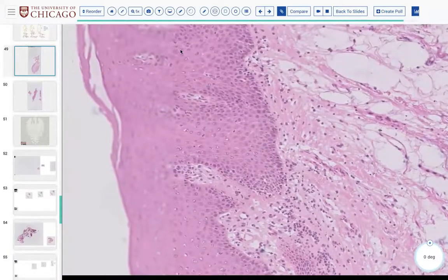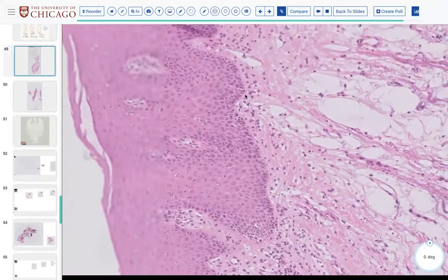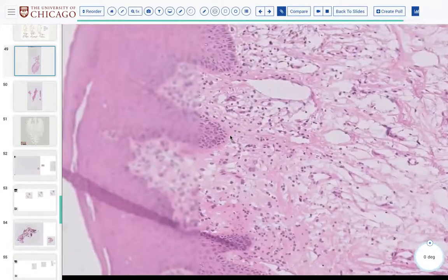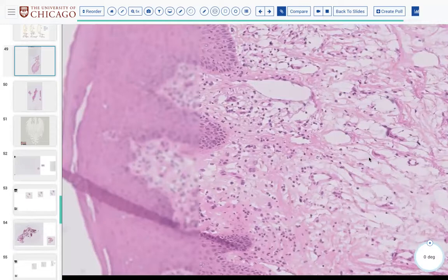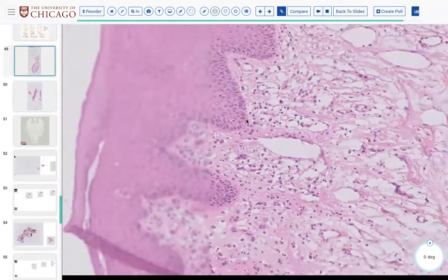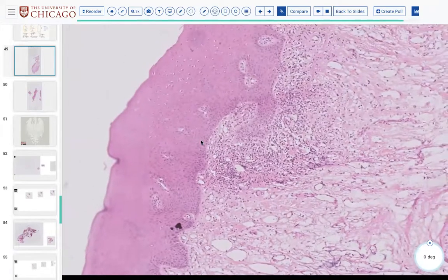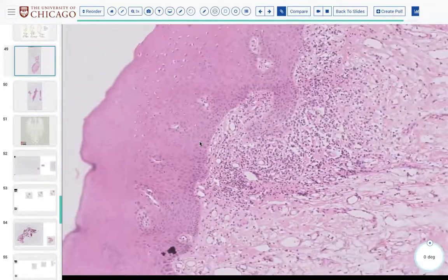Have you guys been having this problem where there's a blurry water line and it's just blurred on one edge of that line? Sometimes, yeah. Why is that happening? I'll have to ask Philips about that. That's insane. It started recently. I had issues with scanning slides for a project, but it wasn't like a water line. It sounds like this is different.